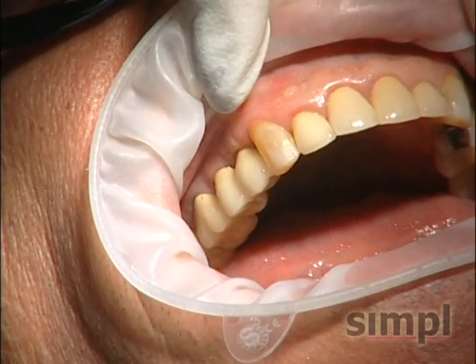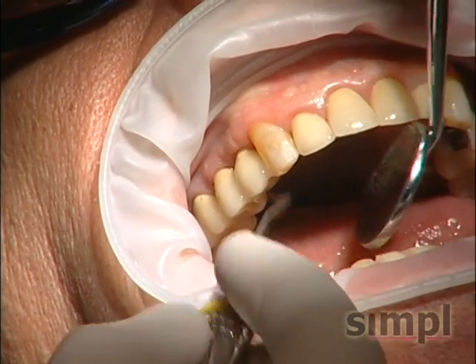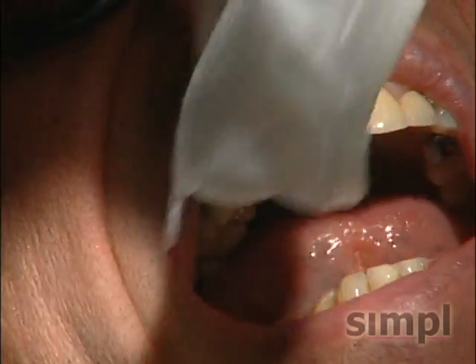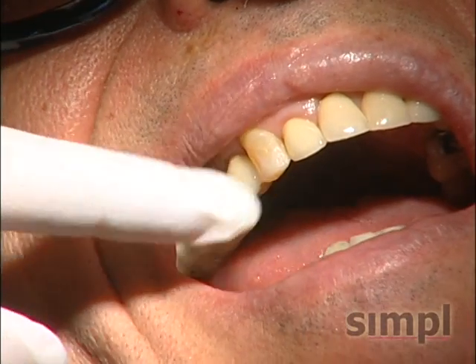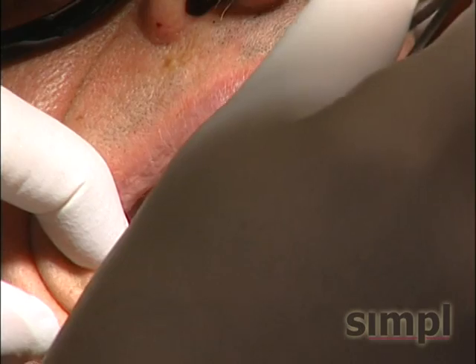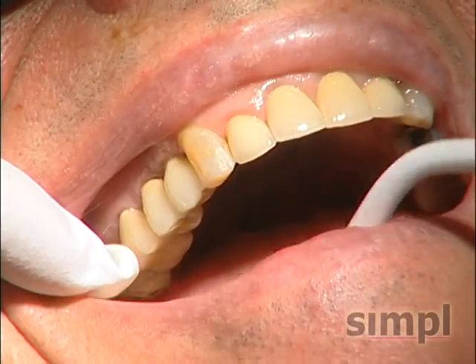And we can see how nice the margins are and how perfect the shade match is. Everything looks great. And I'm going to take everything off now. Check the occlusion one more time. And bite down, tap, tap, tap. Open. Give me a piece of paper, please. We'll do that one more time.